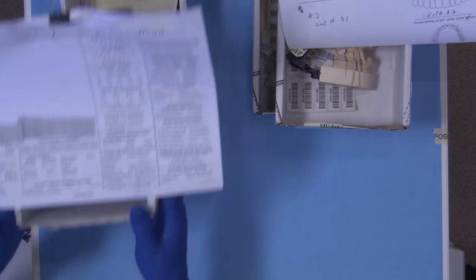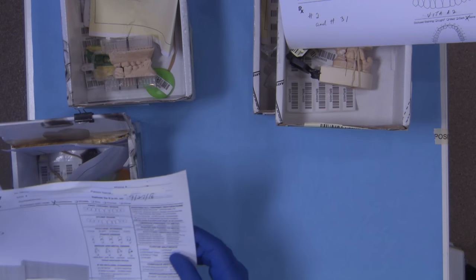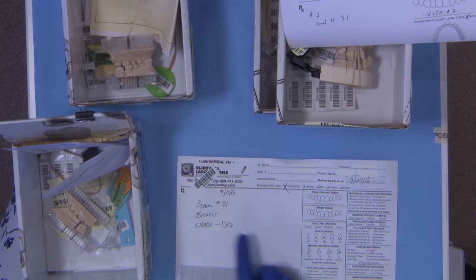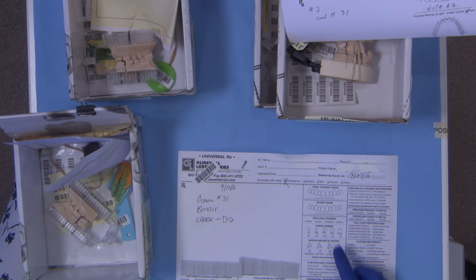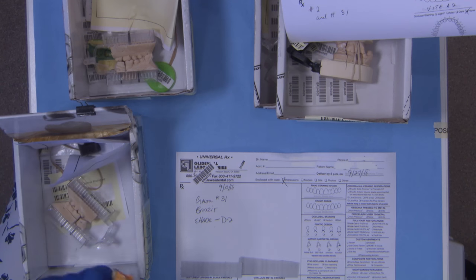To illustrate how common this problem is, I will share with you some examples that I gathered from the lab floor. It is not surprising that I found a few cases. Here we have case number one. A doctor sent this asking for a Bruxzir crown on number 31.